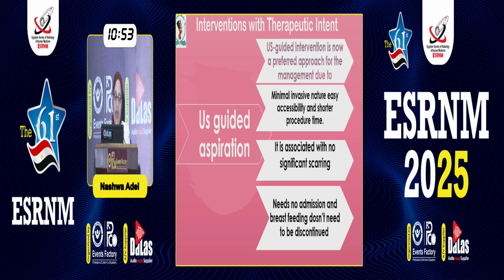Ultrasound-guided intervention is now the preferred approach for management due to its minimally invasive nature, easy accessibility, and shorter procedure time. It is associated with no significant scarring, needs no admission, and breastfeeding does not need to be discontinued.